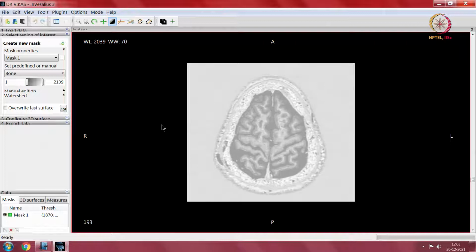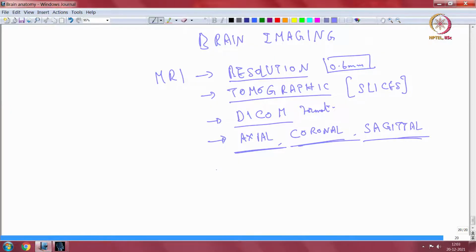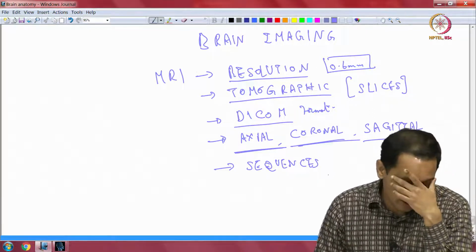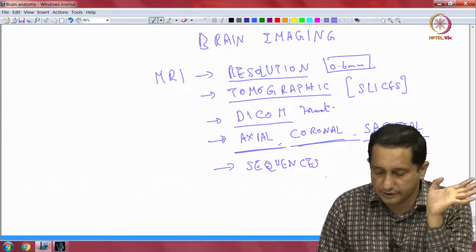Now, I have not spoken to you about MR sequences, which I have to speak about. I spoke to you about how hydrogen is given a magnetic field and then radio frequency pulses.